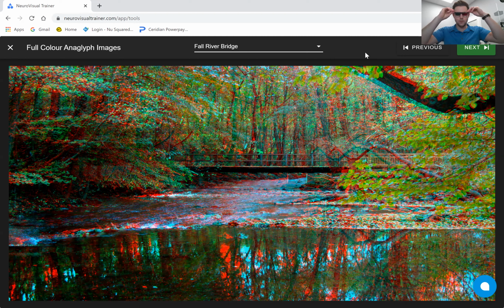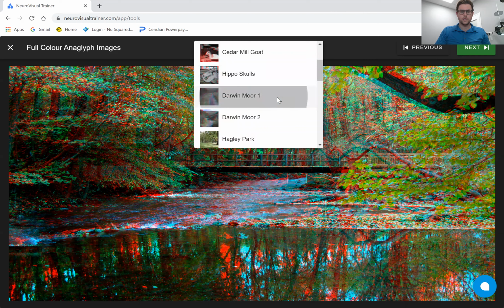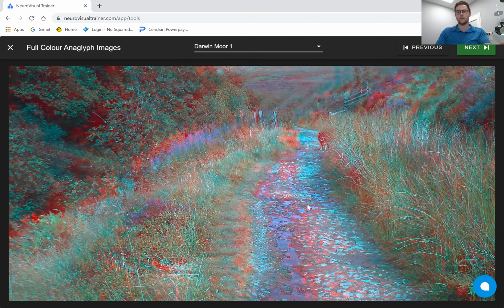I'm playing with it a little bit here, left and right, and you can see it responds really well. It is some real live ability to experience depth. I know there's some websites that people can use for this, but they've actually done a really nice job integrating a ton of different options. You can see we're walking on a pathway.